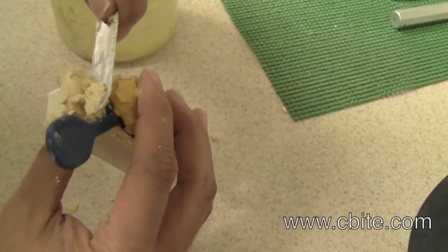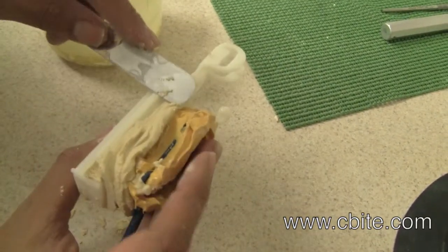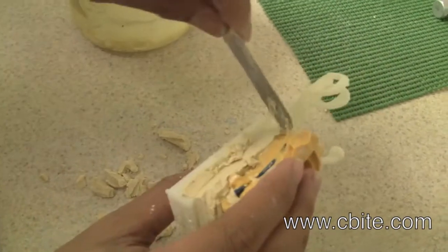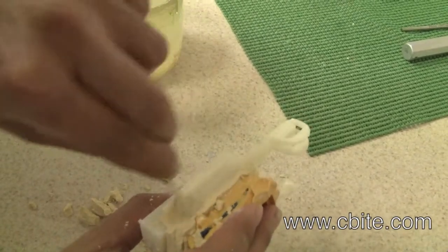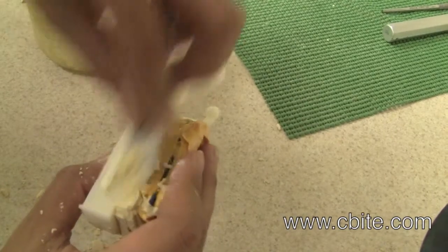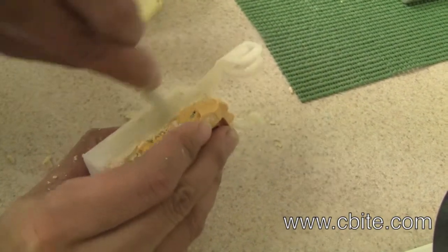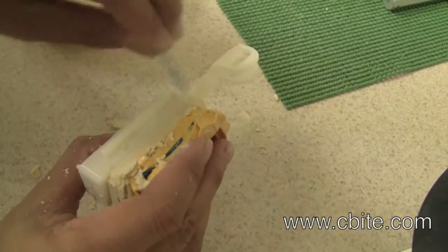The stone is already starting to set. When the stone starts to fall apart like that, it's getting hard, so you have very little time left. The more excess stone you can remove at this point, the less grinding you have to do once the stone is fully set.